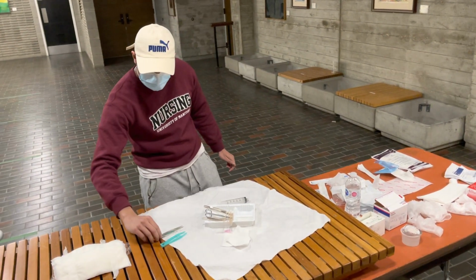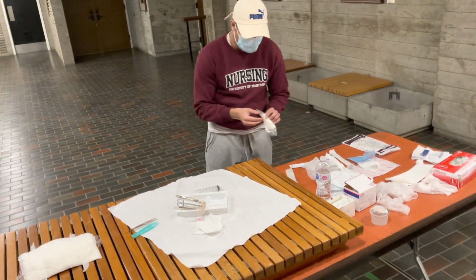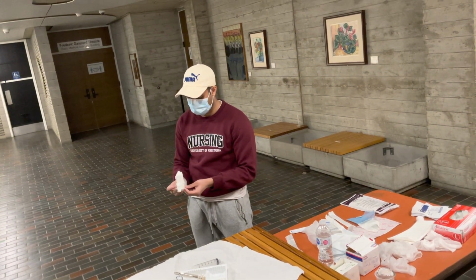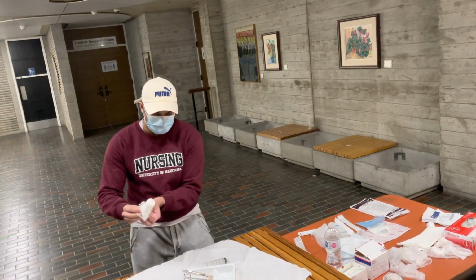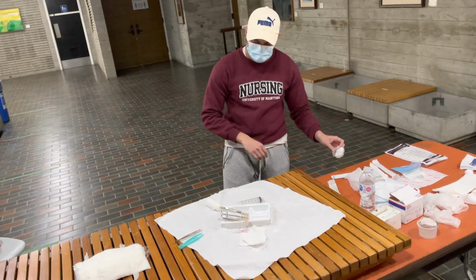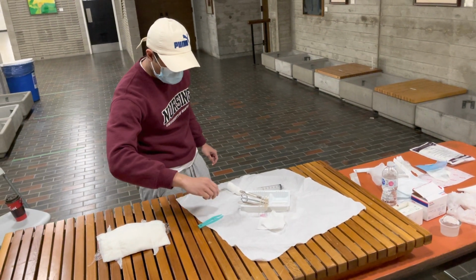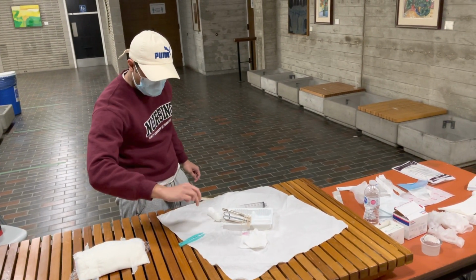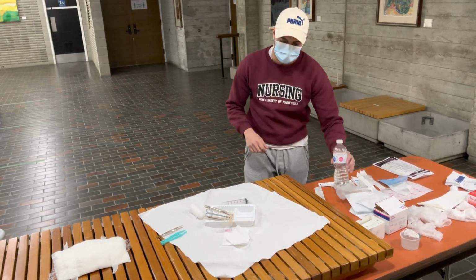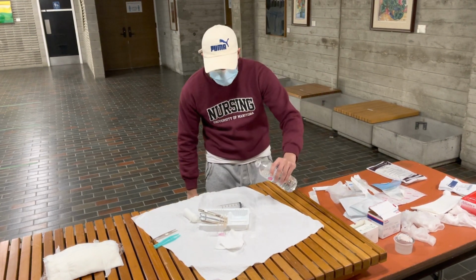Okay, and now we're just going to add in our products. Opening it up like this. Okay, and putting it in. Okay, and this is still within the sterile field, so we're just going to move it a bit closer. Okay, we're going to add our sterile water here.